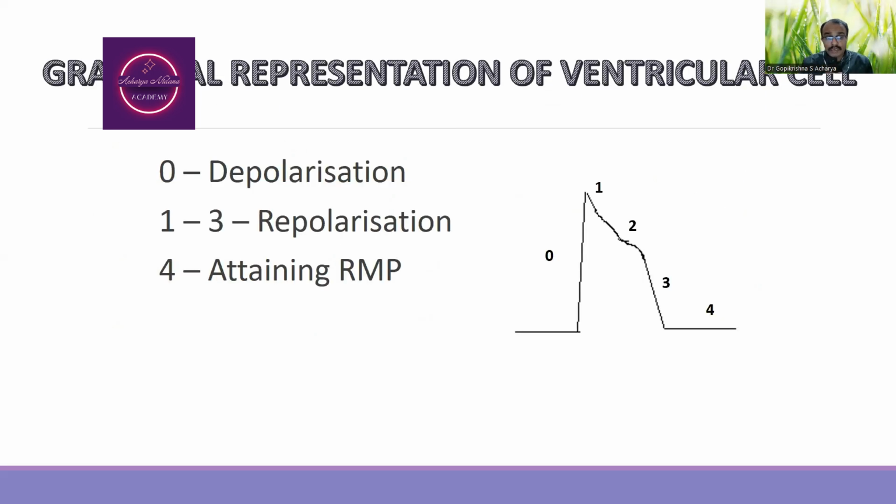When you think about the graphical representation of the ventricular depolarization or ventricular activity, this is considered to be the graphical representation.